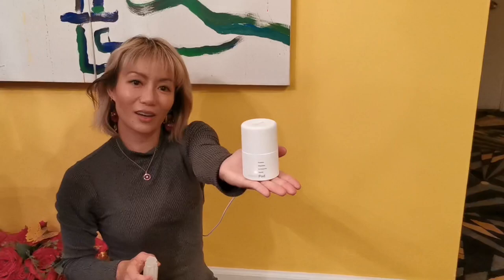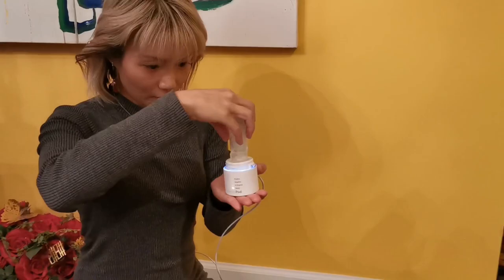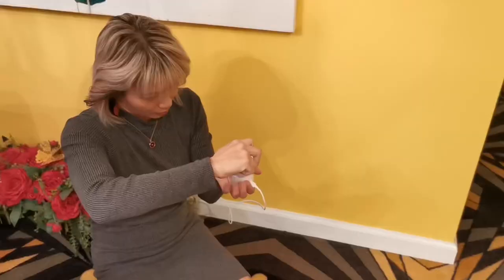It's not blinking anymore. And I can feel that it's warm right now. So, let me put this in. Ta-da! Just closed it. So now it's in progress.